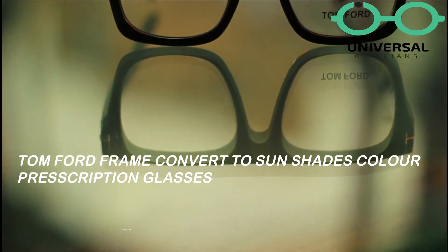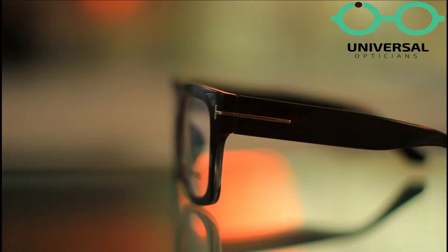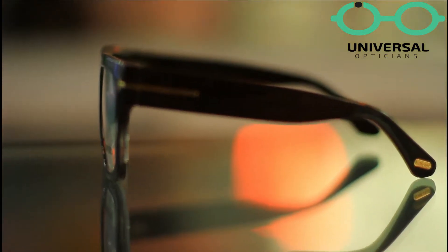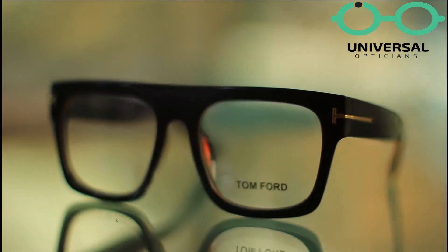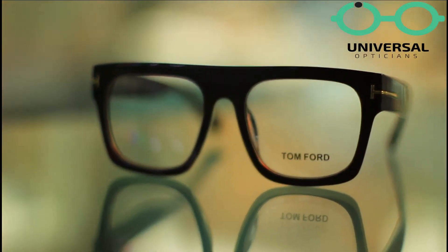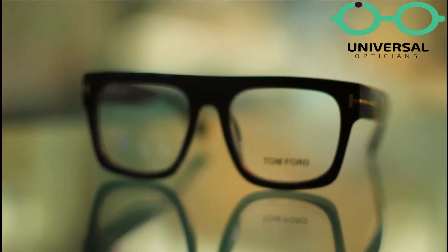Asalaam alaikum and welcome back to Universal Optition. Today's review is very interesting because today I will tell you that I have a Tom Ford frame converted to sunshade prescription glasses. This is basically a thick side frame and inside the eye side we have color-shade lenses.